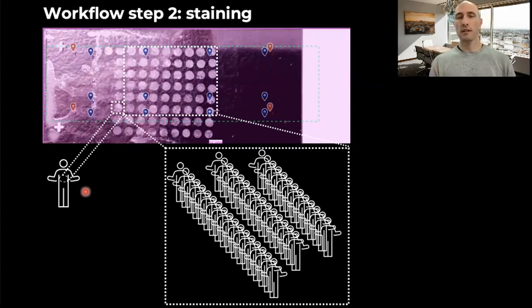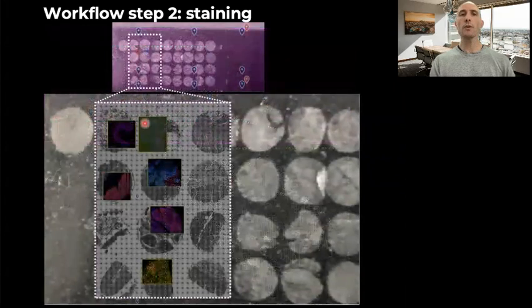And then as Hyperion is all automatic, you will set up the software and it will ablate all these cores and you will walk away. So you can have 70 patients, 72 patients in the same slide, and you walk away and you will have results in less than 3 or 4 days for all these patients. You can even run overnight and you don't need to be there. Just go there once the results are in your hard disk, and then just take it and do data analysis. So again, when possible, my recommendation is use tissue microarray.